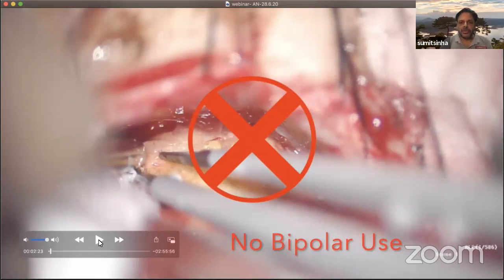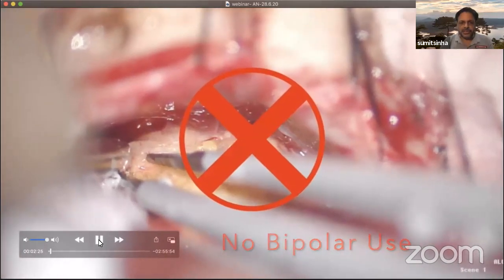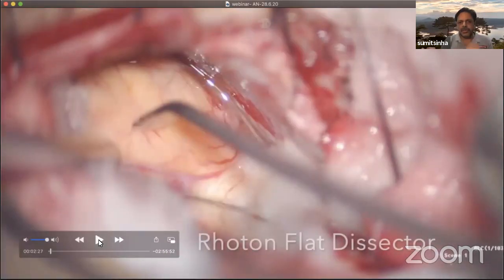And as you can see in my video, I have trained myself now to use this bipolar as little as possible. I understand that without using a bipolar, it will be very difficult to do the surgery, but you can train your instincts to at least not use bipolar outside the tumor anywhere. Of course, inside you can use the bipolar, of course you have to use it, but outside the tumor capsule, no bipolar use.